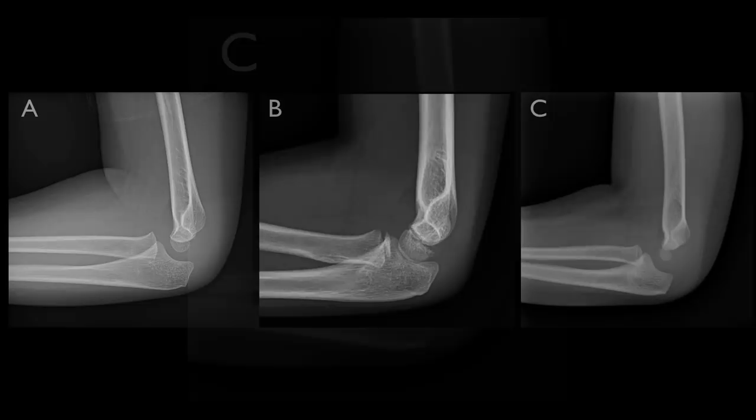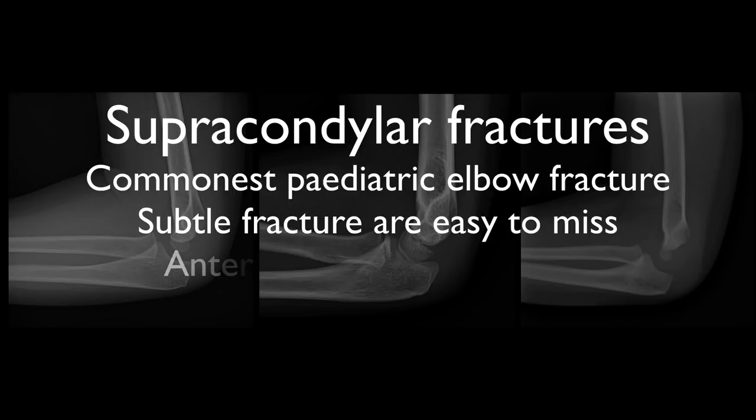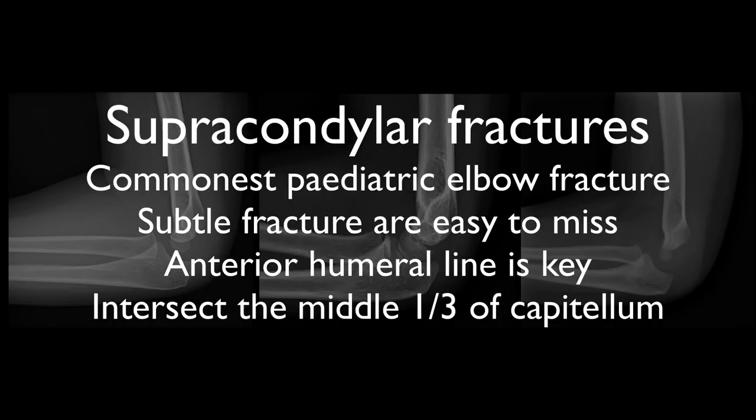So we have seen two cases of supracondylar fractures and learnt that they are the commonest paediatric elbow fracture and subtle and easy to miss in certain circumstances. In these subtle examples the anterior humeral line is key. It should always intersect the middle third of the capitellum, and where it doesn't we should look for associated elbow effusions or minor cortical irregularities that herald the supracondylar fracture.